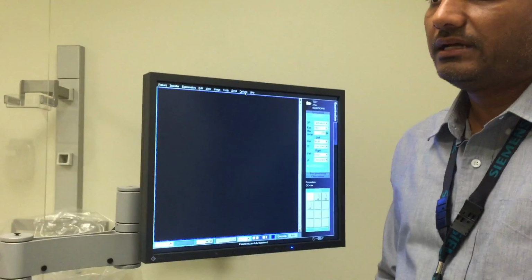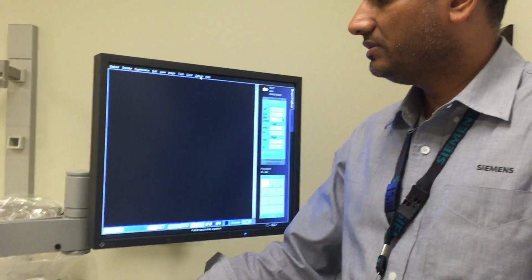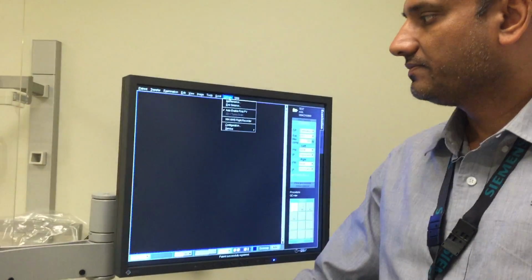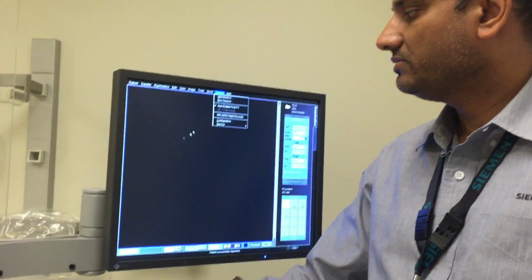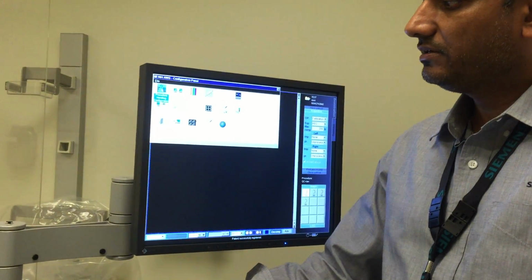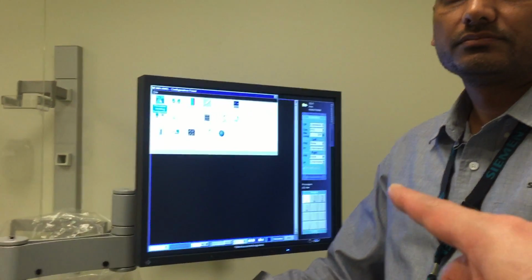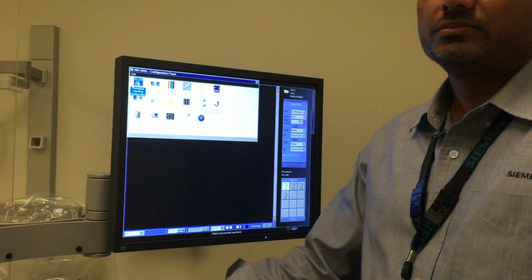Right. But usually, does she have to go to the service mode, or no, it's a user, on the acquisition mode? User access. Okay. It's an image screen from their option config, and then procedure handling configuration. Okay. Oh, we just left service mode just now. This is not service mode. It's not a service mode. Okay.